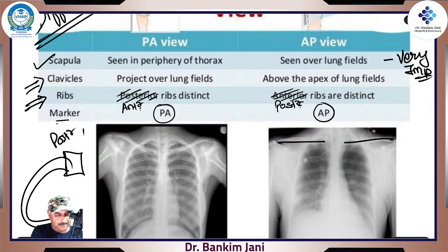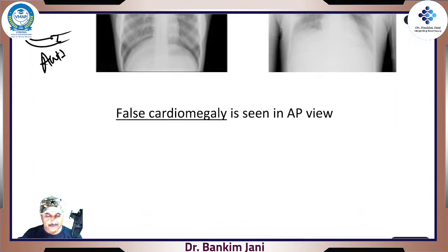That's where the marker is put. Normally you'll find a marker like over here, right? There is a marker. So these are the differences, right, where you see it.